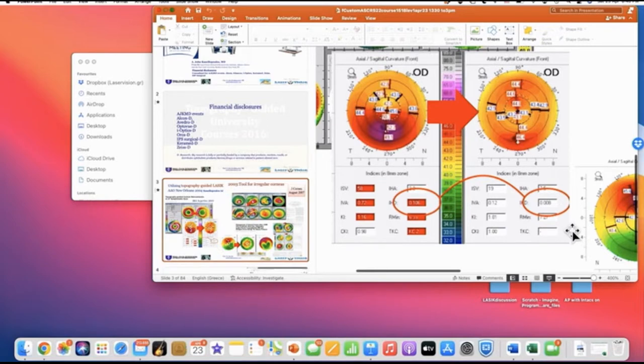If the only thing you carry out of this room today is knowledge of what the IHD is, my work is done. The IHD is one of your options on your Pentacam when you press on topometric indices. Oculus is very cryptic about telling you how they calculate this, but in essence, it goes to the steepest part of the cornea, and then it goes to the diametrically opposite part of the cornea in regard to the vertex, and measures that difference. Actually, it takes several spots. So it takes several spots here and several spots here, and it measures that within your optical zone, how much irregularity is there? Index of height decentration.